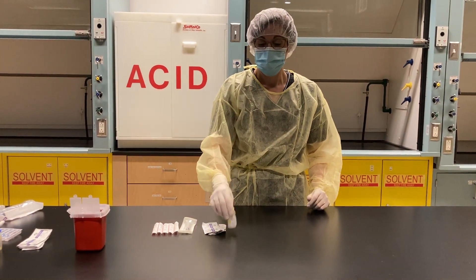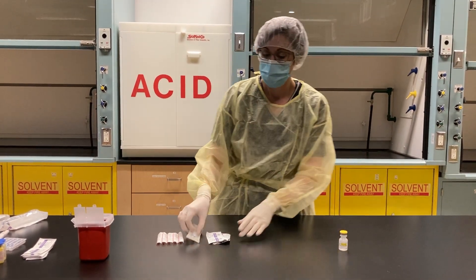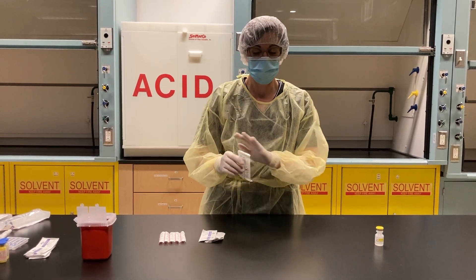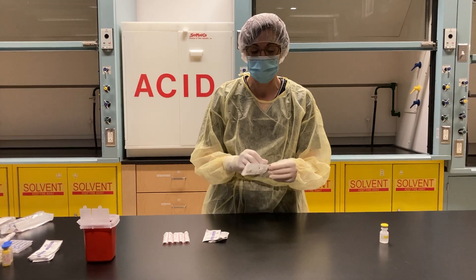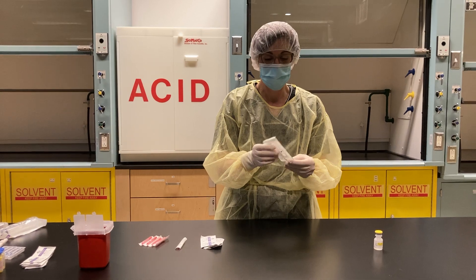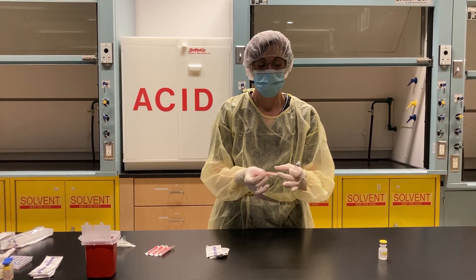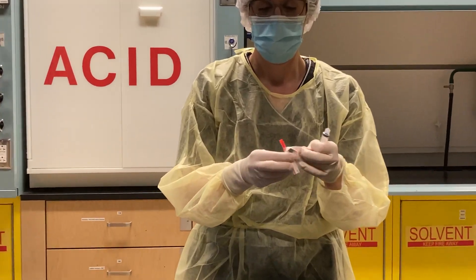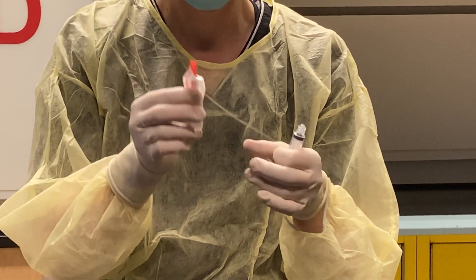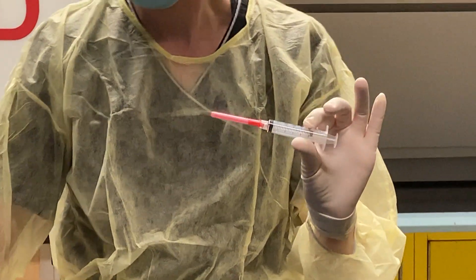Now we are going to practice drawing up from a vial. The first thing I want to do is attach my needle to my syringe so that there's no way there could be particulate affecting my critical sites. To attach a needle to a syringe, first you take your syringe out of its package. Open up your needle from its packaging facing upwards and then it just screws on to your syringe.